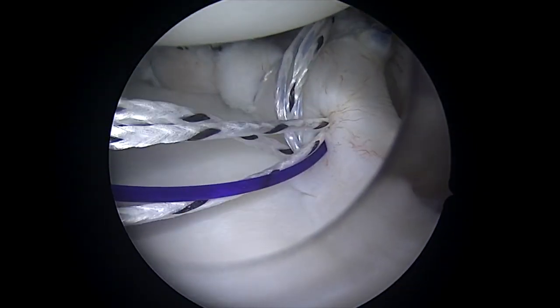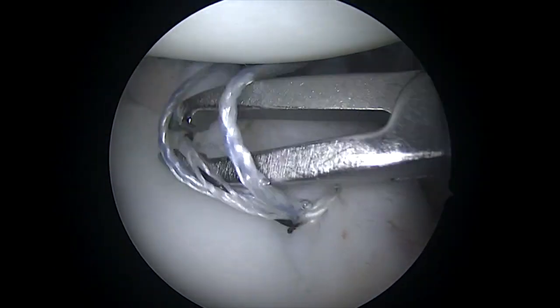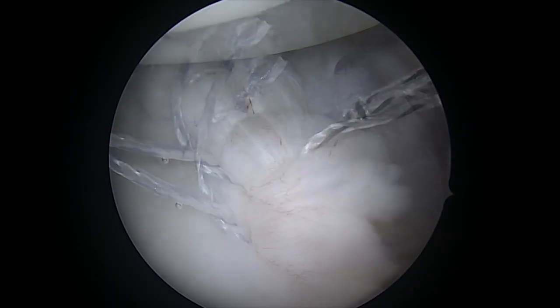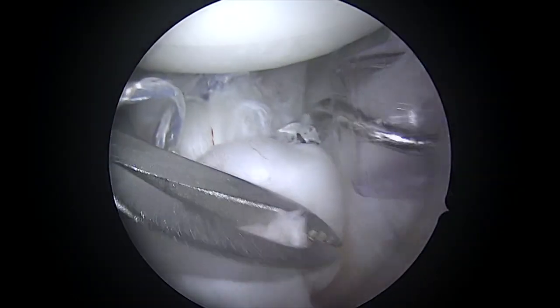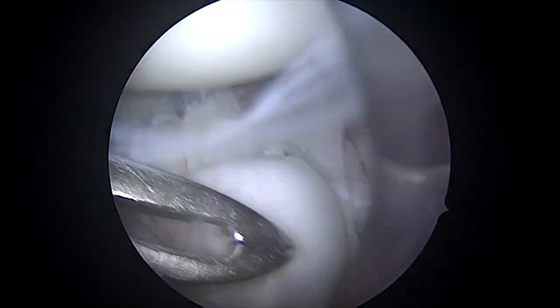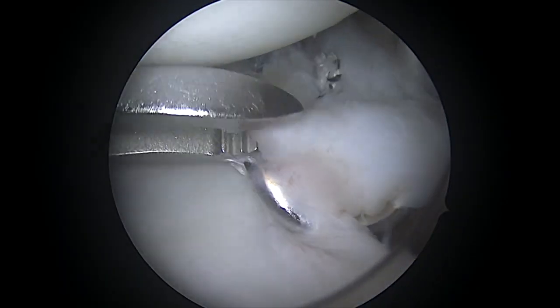As we go, I will typically also do a posterior capsular plication. This particular patient doesn't have any posterior instability symptoms, even though she has capsular laxity as the main problem. So in this particular patient, we actually only did the front — but most critically in these patients, it's almost always both the back and the front. For me, this typically requires a minimum of five or six anchors.